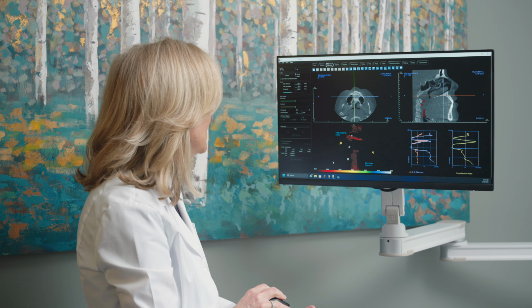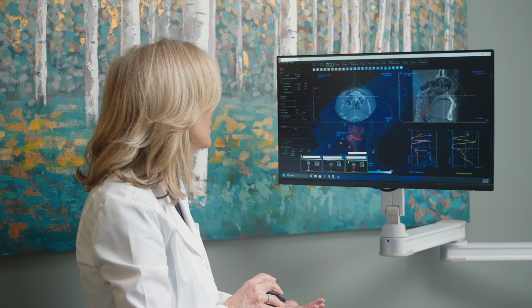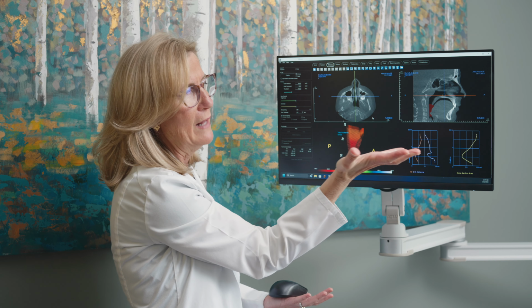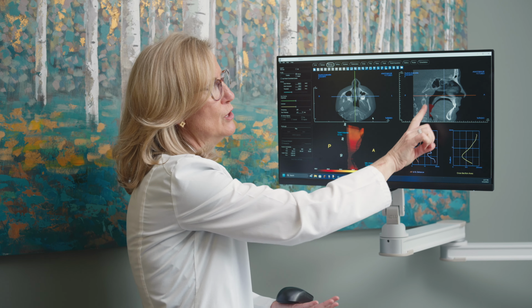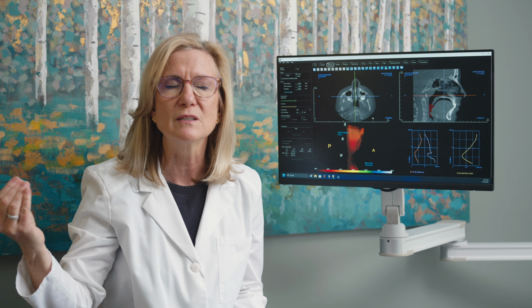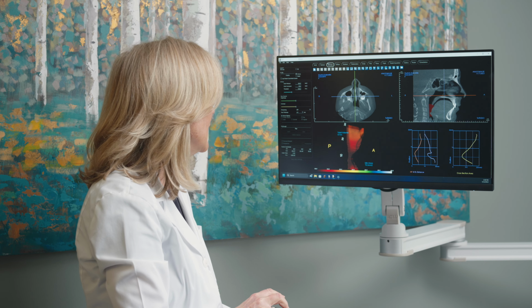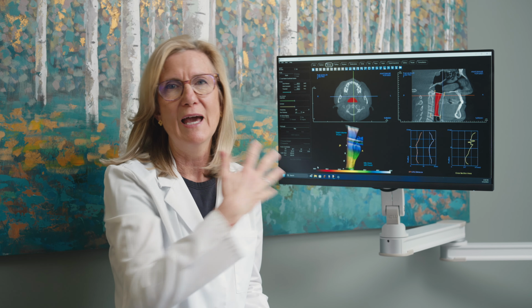In her case, no. But in the case of the child, she's actually in ortho right now, having her palate widened, and we're training myofunctionally correct tongue posture so we can make her airway bigger and help her sleep better at night, help her develop better as a child, help her think more clearly and breathe more clearly and have a healthier life. So that's the benefit of this sort of imaging that gives us all kinds of information for a healthy airway and a healthy life.